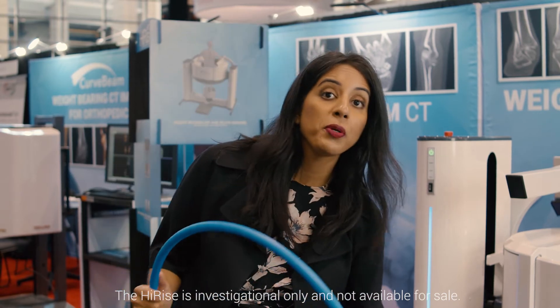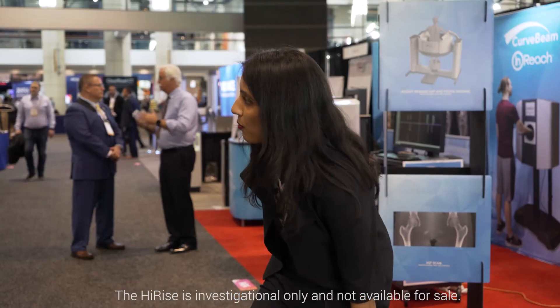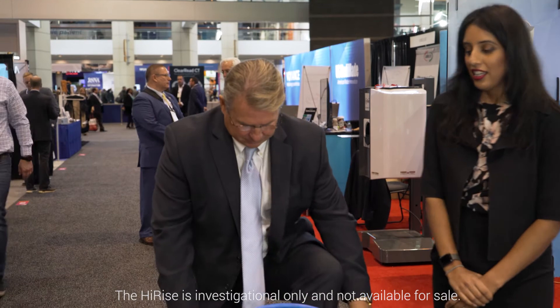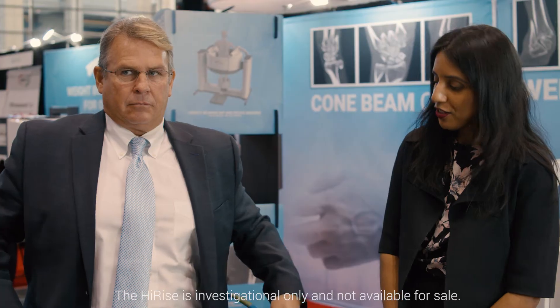This hula hoop demonstrates the size of the gantry opening. A colleague demonstrates that he can comfortably fit inside the gantry as well — there's plenty of room.